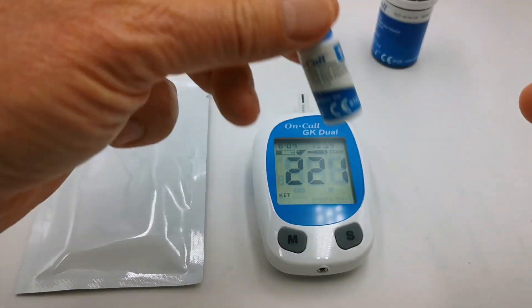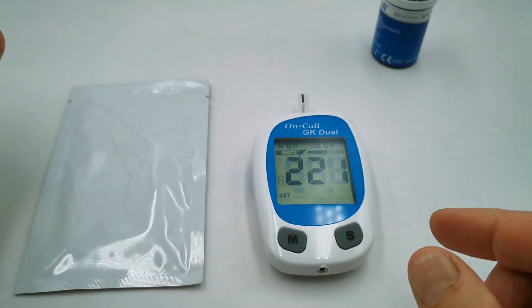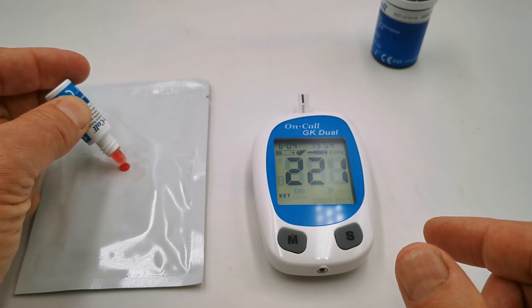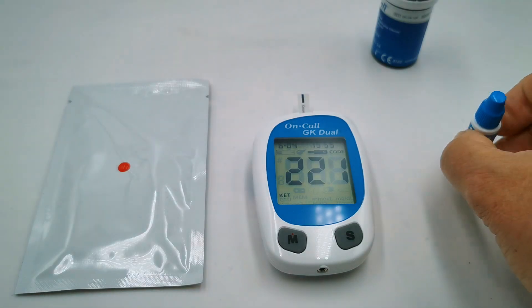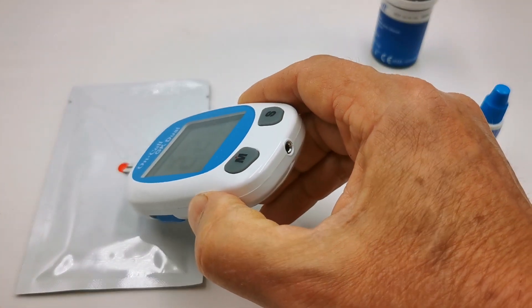Now take your solution one control. You can use any of the three solutions that they make for this. Put a droplet onto a clean non-absorbent surface and then feed the test strip into the drop.